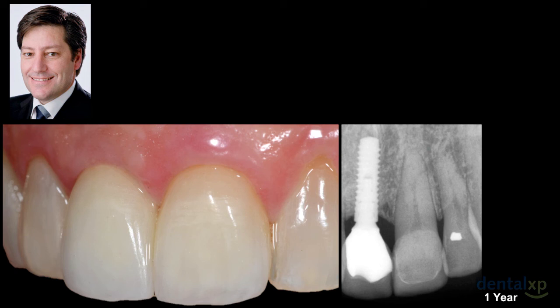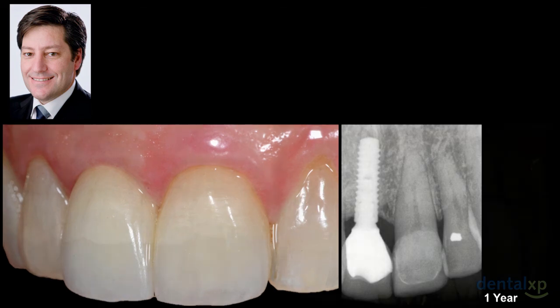So what we will see, dear colleagues, is not only the type or the design, but we will start seeing a lot of this adhesive restoration in the aesthetic area, because for the dental technician, it's easy to work with the same thickness and same underlying structure with the same color to achieve the aesthetic outcome.